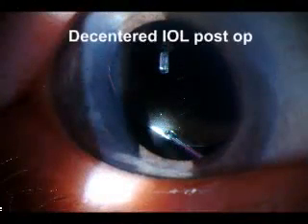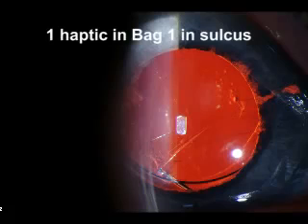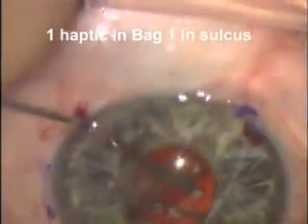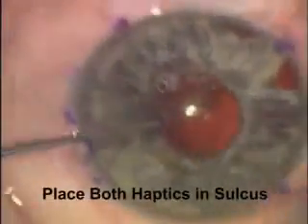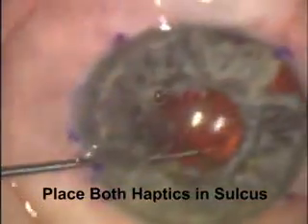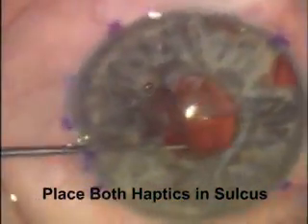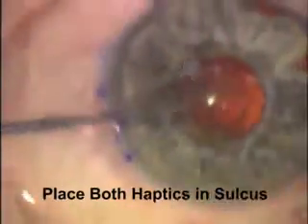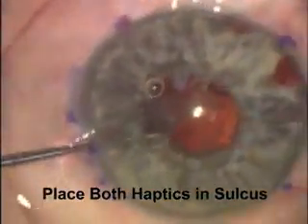Here's a decentered intraocular lens that was noted postoperatively. It was a complicated case — one of the haptics is in the bag and one is in the sulcus. There's less room in the bag, so the lens decenters. Here's a similar decentered lens in a patient that had had cataract surgery with a trab. The haptic which was in the bag was simply rotated out of the bag so that both haptics were in the sulcus. You're better off with both haptics in the sulcus than with one in and one out. This lens was far better centered when both haptics were placed in the sulcus.